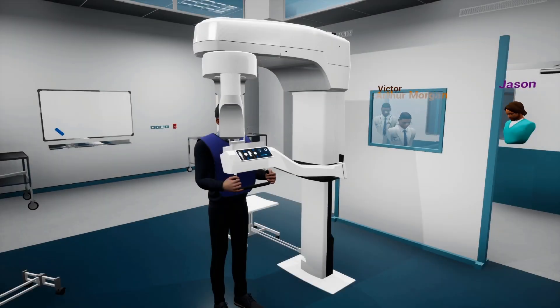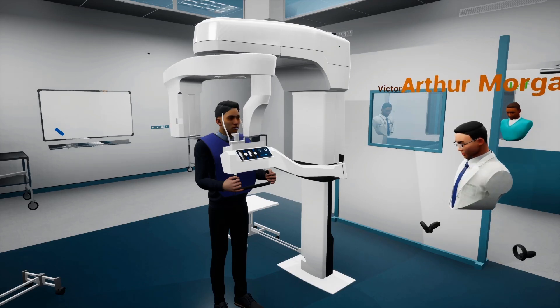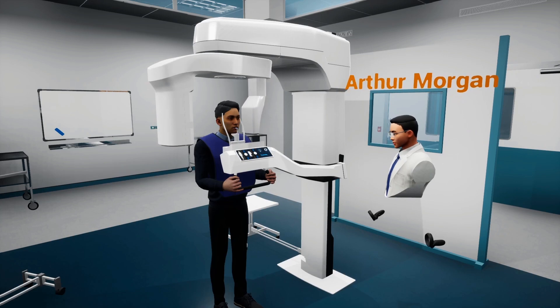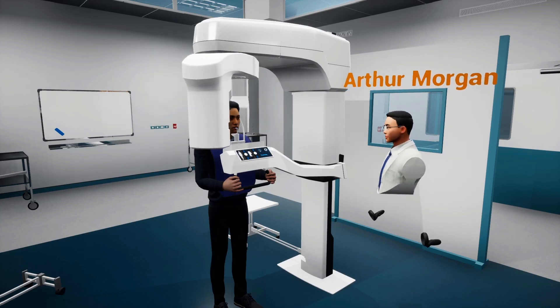Press the power button to start taking images. Since this is a VR experience and not an actual x-ray machine, we can get close to the machine and observe how it works.